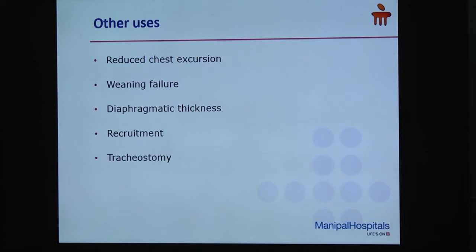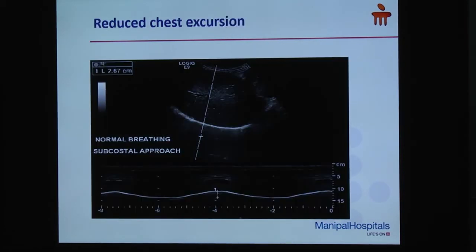It can be used by the physiotherapist to assess the recruitment of lung. And more and more people are doing that, instead of going for a chest x-ray, which you can do only once in 2-3 days. This you can do before and after every physiotherapy session, and there are papers on that as well. And it can obviously be used for tracheostomy.